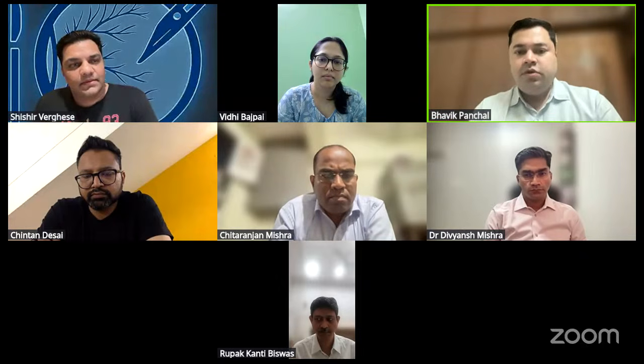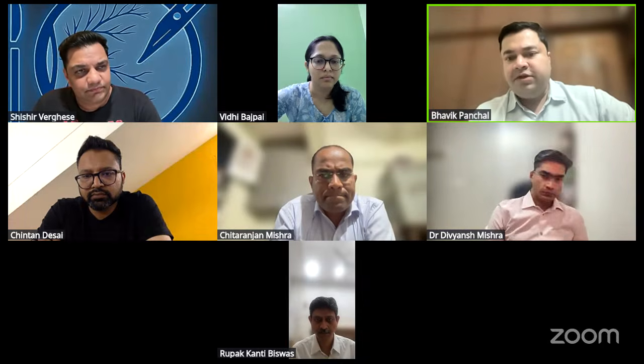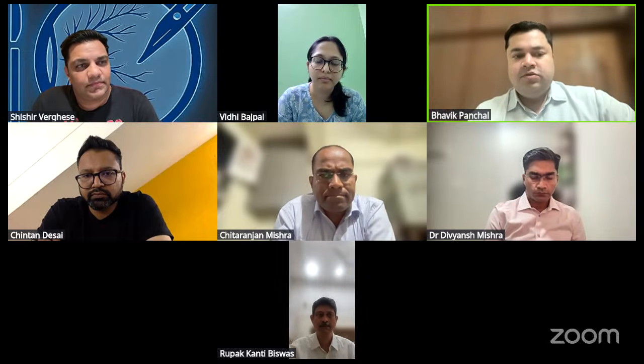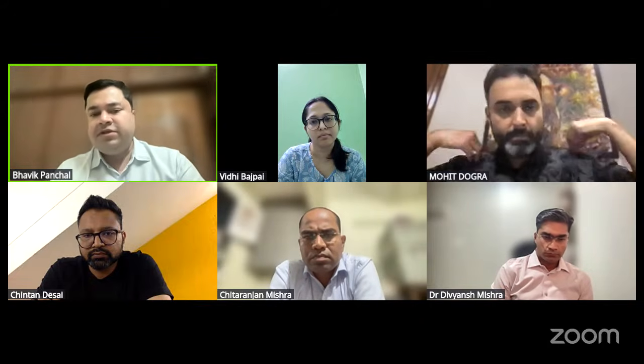Great. So two different techniques, and one important point was Vidhi, you just put air, right? You did not use the gas. Whereas Shishir also used an SF6. So Dr. Divyansh, what do you think is a better stability or a higher chance of hole closure comparing multi-layered versus just a large temporal flap which is just turning upon itself? We'll discuss the air and the gas later on, but we'll first go with this technique part.